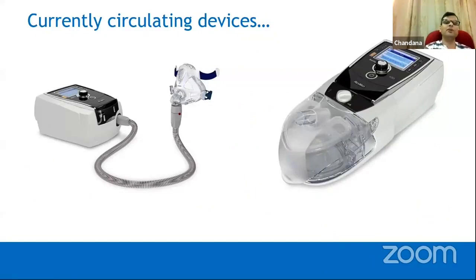You have a single tubing attached to a vented mask, and you connect it to a non-vented mask. You don't use this vented mask which comes with the device. Use a non-vented mask and attach a bacterial viral filter, and attach an exhalation port, and then connect this tubing. So that is how you should connect the ResMed device to a patient.